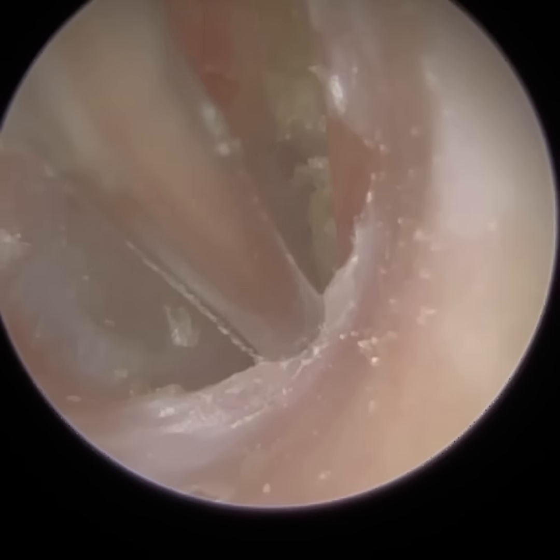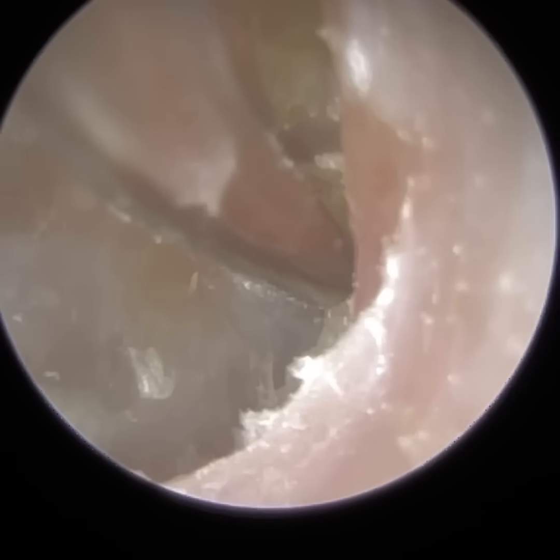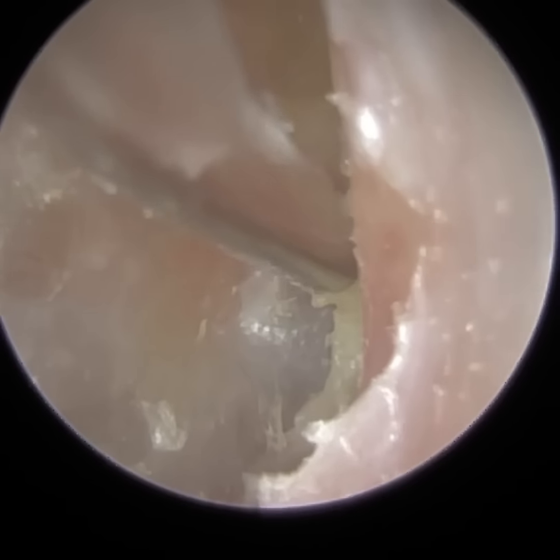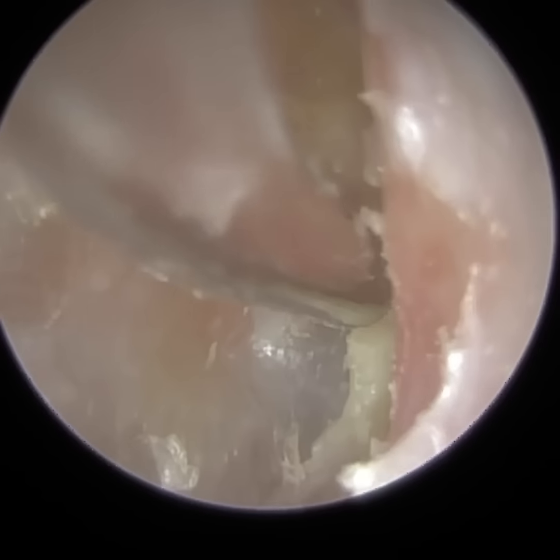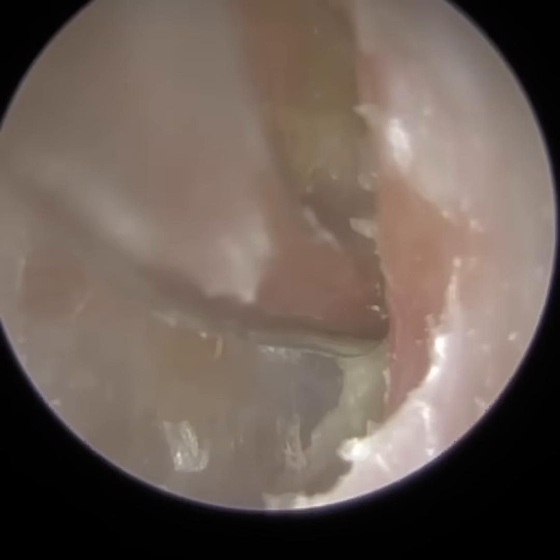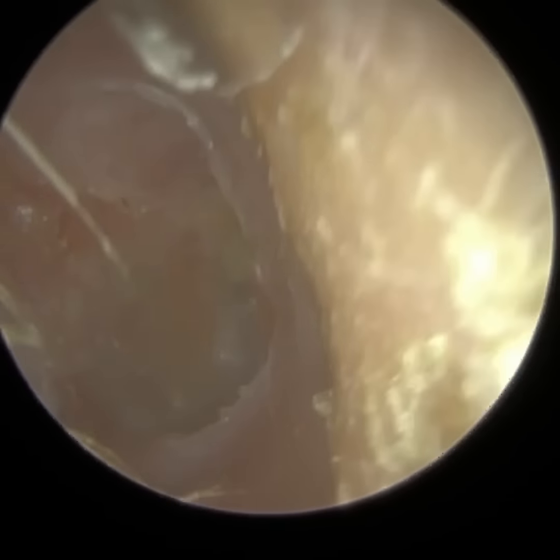Now, I think this is the early stages, very, very early stages of medial canal fibrosis. That, what I just removed, felt more fibrous. So there's a condition called false fundus or medial canal fibrosis, where you get this buildup of fibrous tissue and eventually it can form a second eardrum. And that certainly felt like more fibrous tissue there.